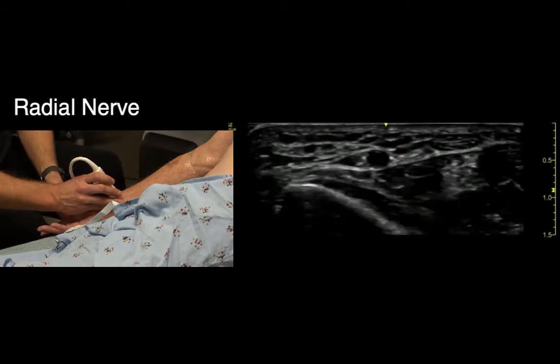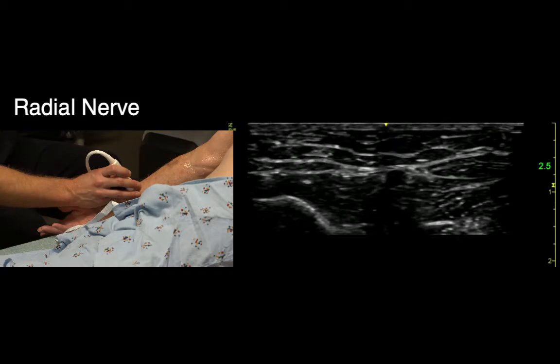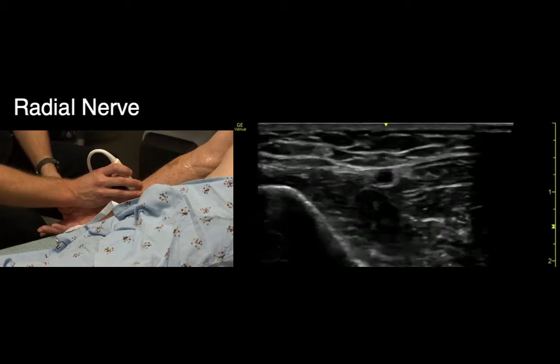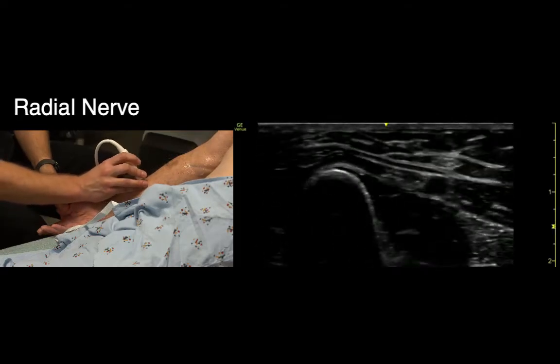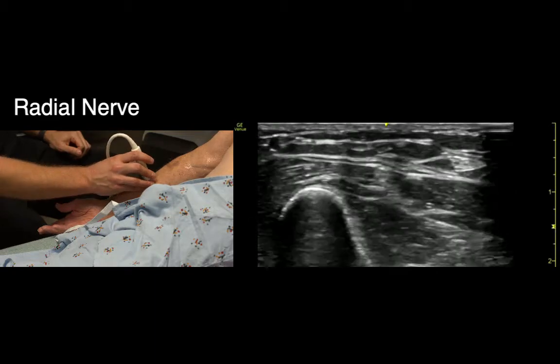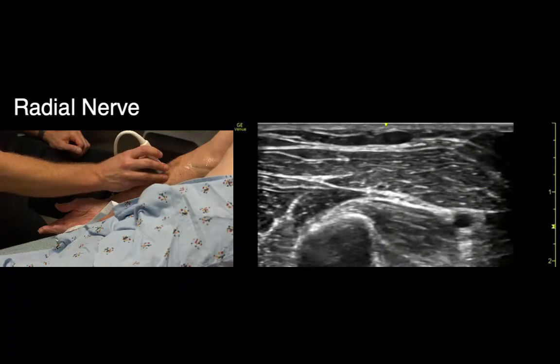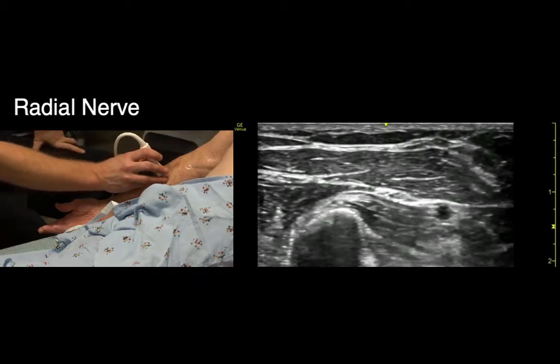It's not usually visible distally, but if we start to track it proximal, keeping the bone and the artery in view, as we track our way up the arm, we start to see the nerve tissue organize itself between the artery and the bone. We can start to see it right here — you guys see the little honeycomb there.